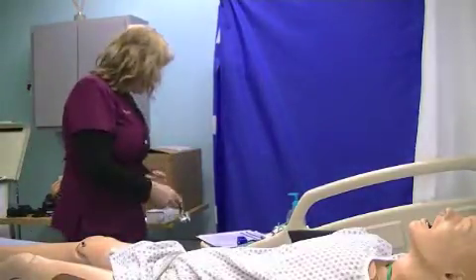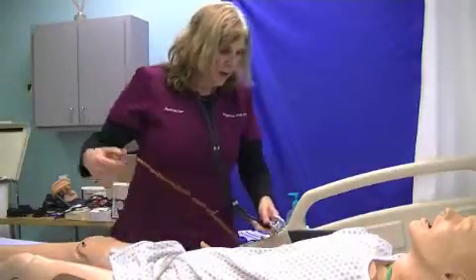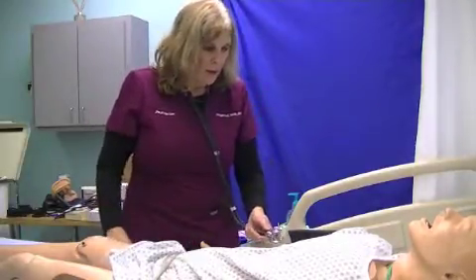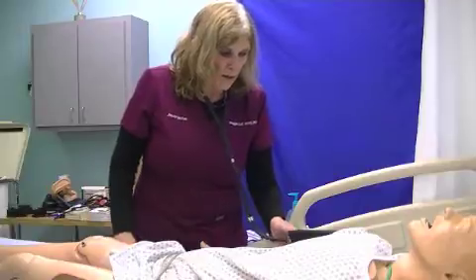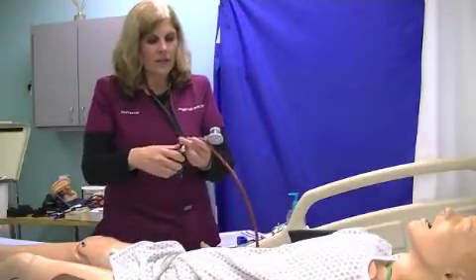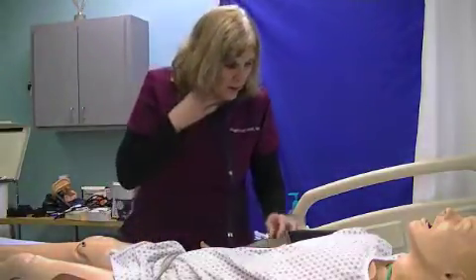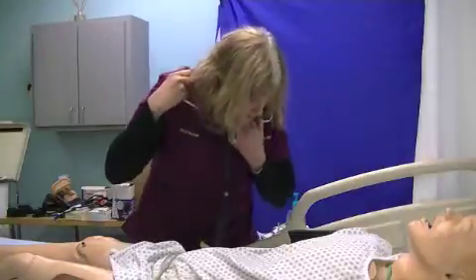All right, so we're going to listen at the artery. This is called the brachial artery, so we have this over the brachial artery. This is called the bulb here. You're going to go righty-tighty, lefty-loosey. You're going to make sure you put this right on the artery. You're going to put this in your ears.